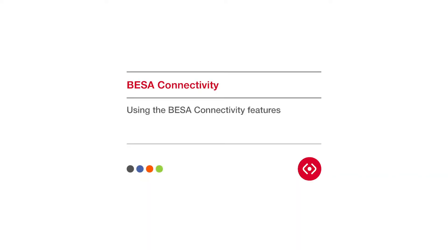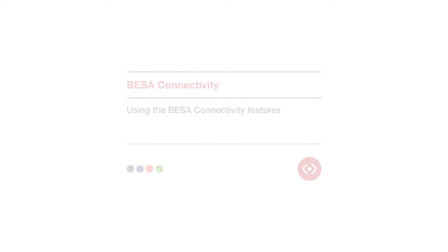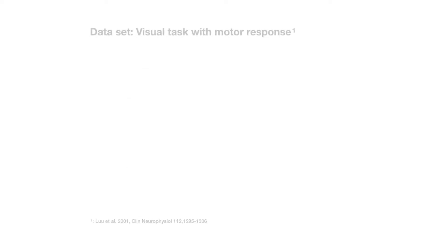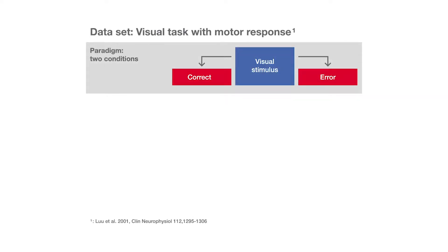In this video, we will explore some of the features of BISA's connectivity workflow in more detail, and how they can be used to find information treasures that are hidden in the data. We have a data set with two conditions, based on correct and erroneous answers to a visual task.